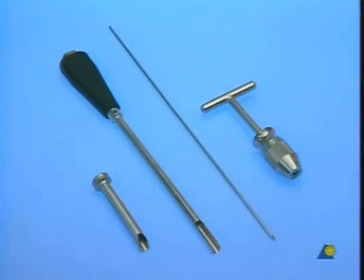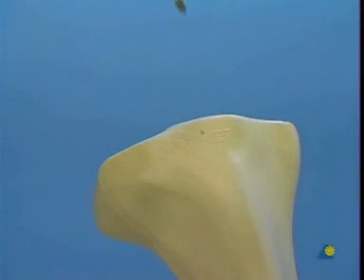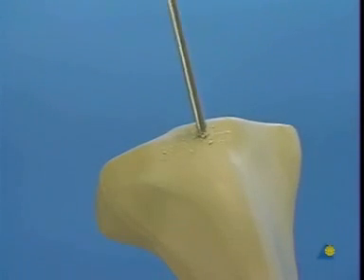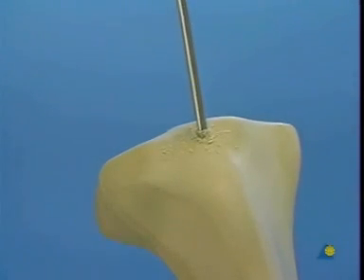The guide pin with the T-handle is used to determine the insertion site on the proximal tibia. The insertion site is situated above the articular surface on the extension of the longitudinal axis of the medullary canal. The thin cortex is opened by rotary movements of the tip of the guide pin.